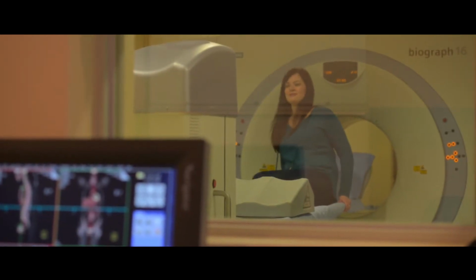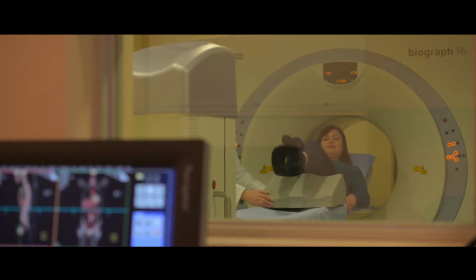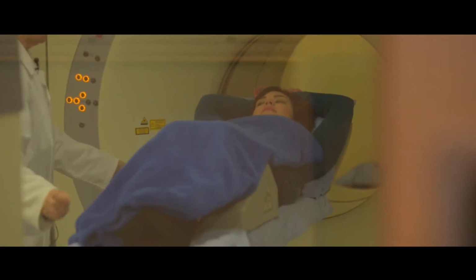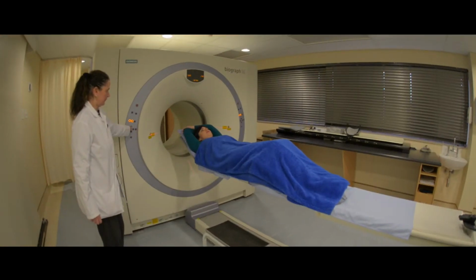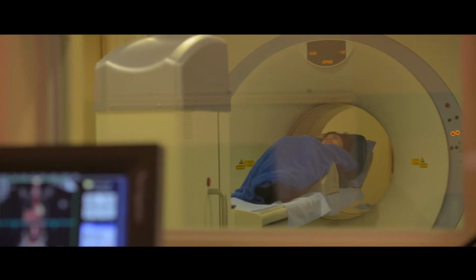You will then be repositioned by a radiographer into the correct position, and usually the scans are done from, we say, eyes to thighs. In certain cases, for example in melanoma, we will scan your whole body. This is the radiographer's workstation, so all acquisition takes place here. The scanning itself takes about half an hour. Processing takes roughly about 5 to 10 minutes.